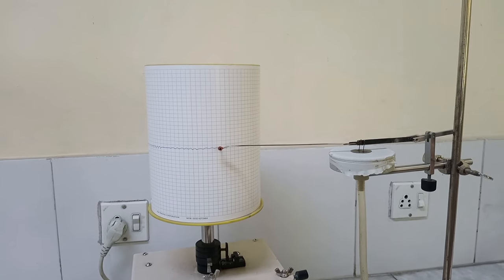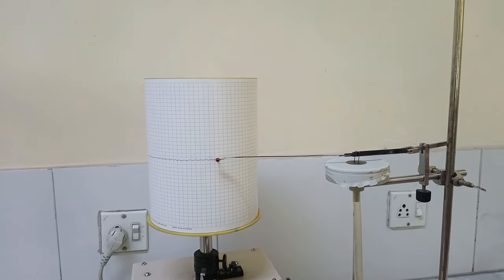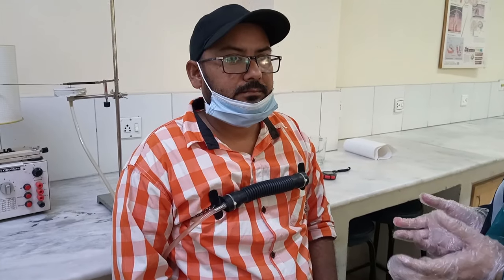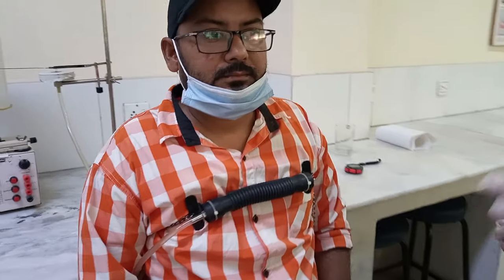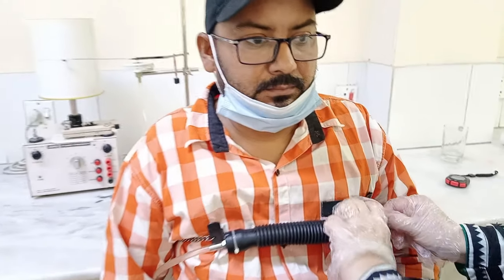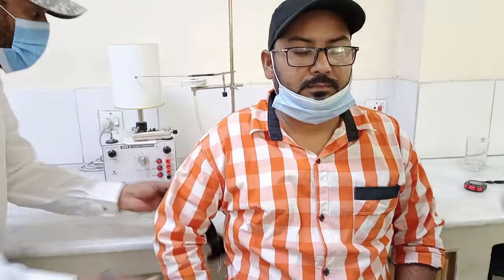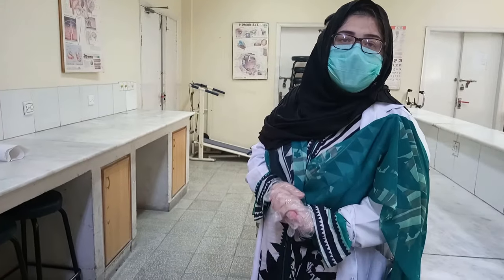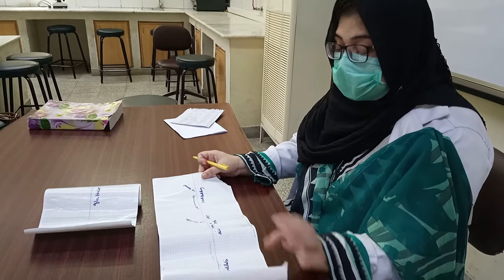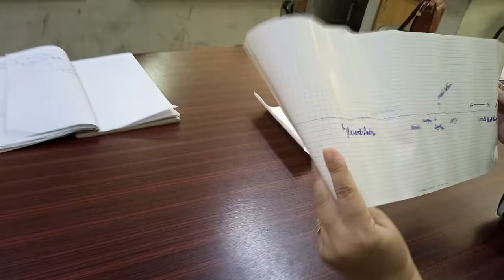Now we will stop the recording procedure. We will remove the stethograph apparatus from the subject. After that, the next step is to examine the graph paper and interpret the pen movements. The paper recordings have come out and we will explain them. This is the same graph paper that was on the drum. Let's see what our starting point was.